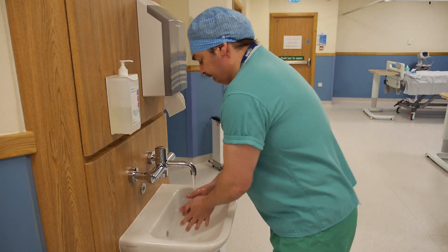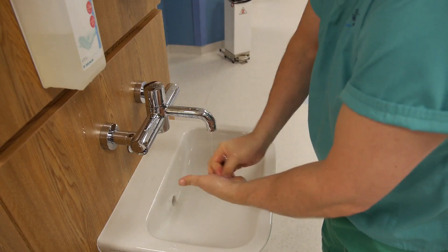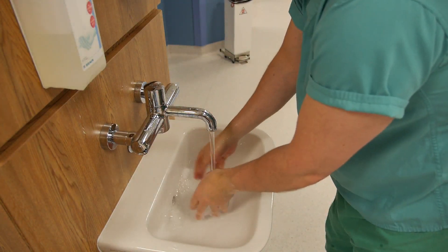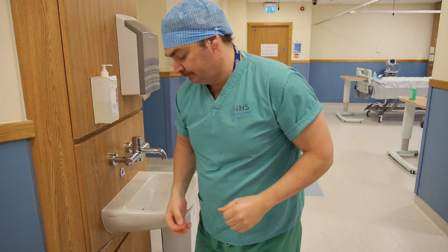When entering the patient zone, hands must be decontaminated before and after each episode of patient care. Liquid soap or antimicrobial disinfectant should be used. Disposable hand towels should be used to dry your hands and disposed of in a foot-operated waste bin.